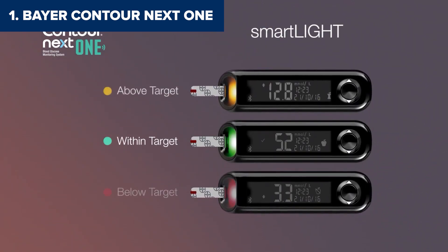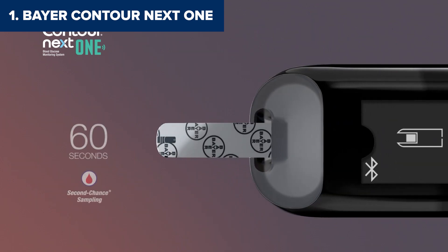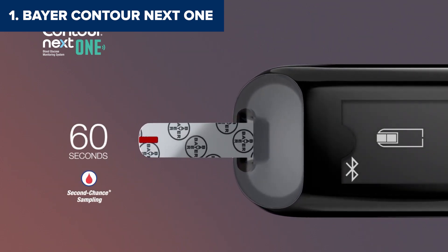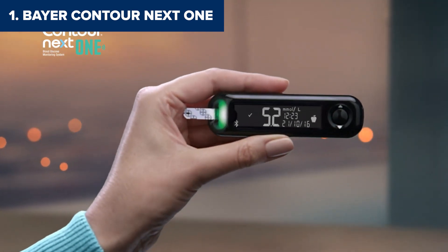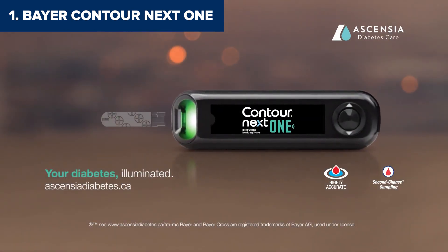While it's hard to find much fault here, the Contour Next One does have a couple of minor drawbacks. The test strips are among the more expensive options, and the monitor itself is slightly larger than some ultra-compact models. But honestly, those are small trade-offs for the level of functionality you're getting. The Beyer Contour Next One is perfect for anyone who values precision, efficiency, and top-tier technology — whether you're a tech enthusiast or just someone who wants to take the guesswork out of blood glucose monitoring, this device has you covered.